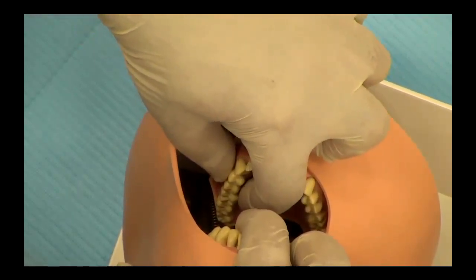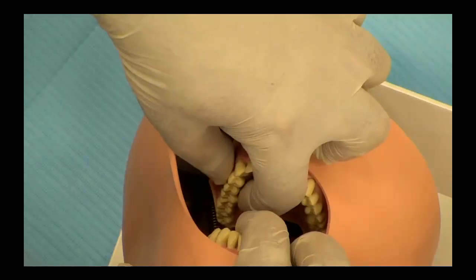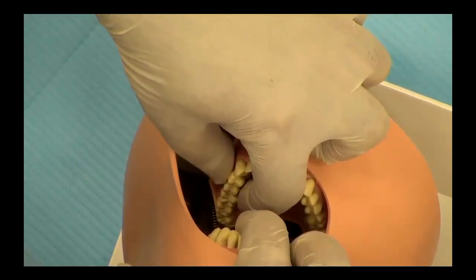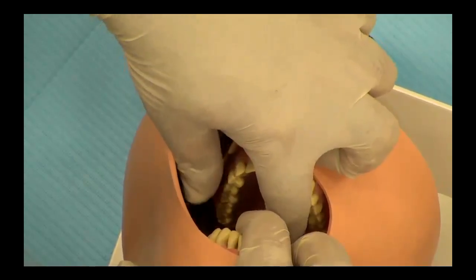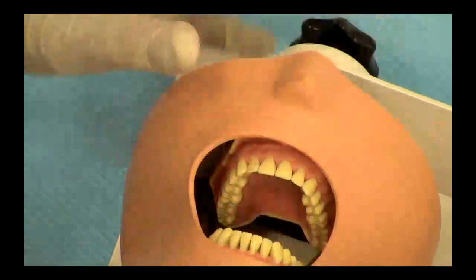So that's the position of the non-dominant hand for the maxillary teeth. This is the position for the maxillary right posterior quadrant: forefinger on the palate, thumb on the buccal side.